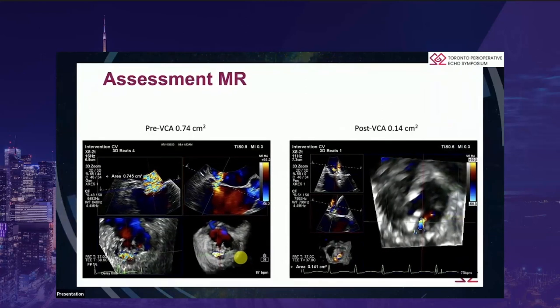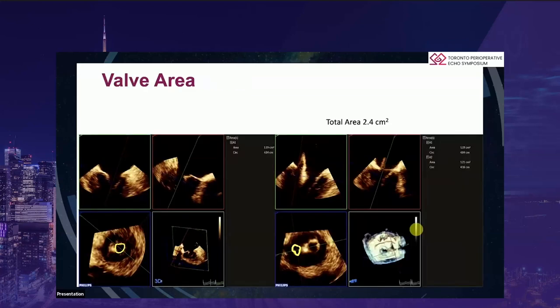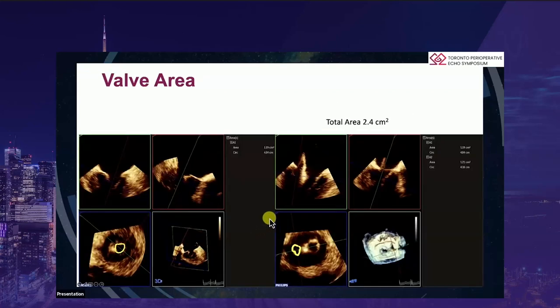Here's assessment of residual MR: this patient had a vena contracta area of 0.74 pre-procedure. After attaching the device pre-deployment, it came down to 0.14 — an excellent result, a clip we're going to accept and release. But before we release, confirm suitable valve area. Here we've moved our blue plane onto the medial orifice measuring 1.2, and then the lateral orifice measuring another 1.2, for a total valve area of 2.4. We're quite happy with this and will let the clip go.